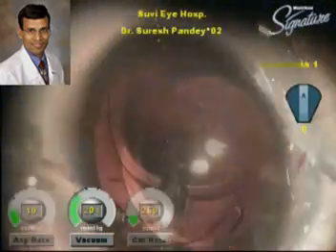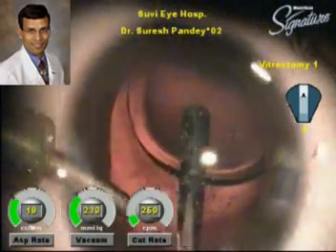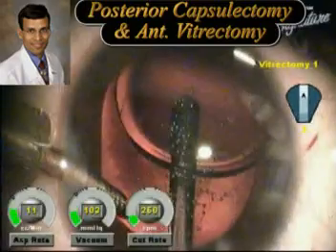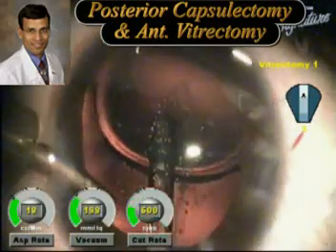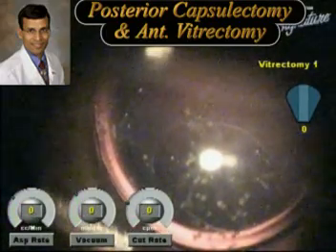It is crucial to remove all the viscoelastic from the capsular bag and fornices, and especially from under the IOL, as we have used dense and viscous viscoelastics like Healon 5. An anterior chamber maintainer is a good idea in these small children because of low scleral rigidity. It maintains the anterior chamber very well.